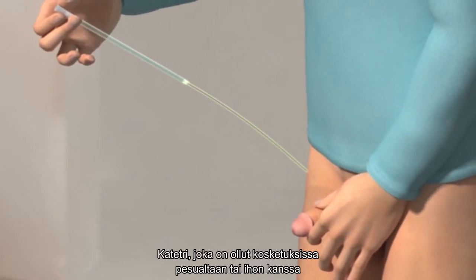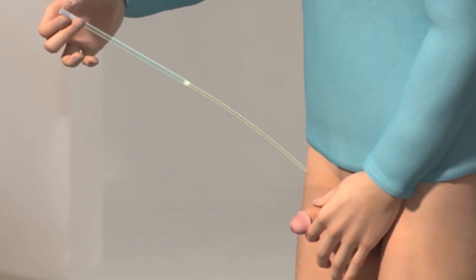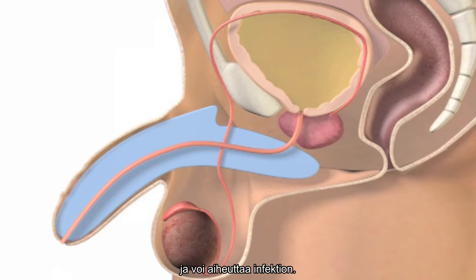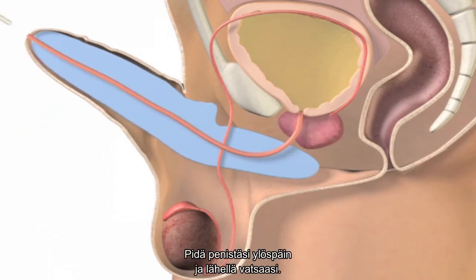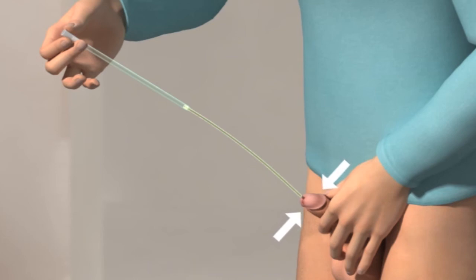A catheter that has been in contact with the sink or your skin may be contaminated and could potentially cause infection. Hold your penis pointing upwards and towards your stomach. This will ease the insertion of the catheter as the natural S shape of the urethra is changed into a U shape. Provide a gentle pressure to the head of your penis in order to open up the urethra.